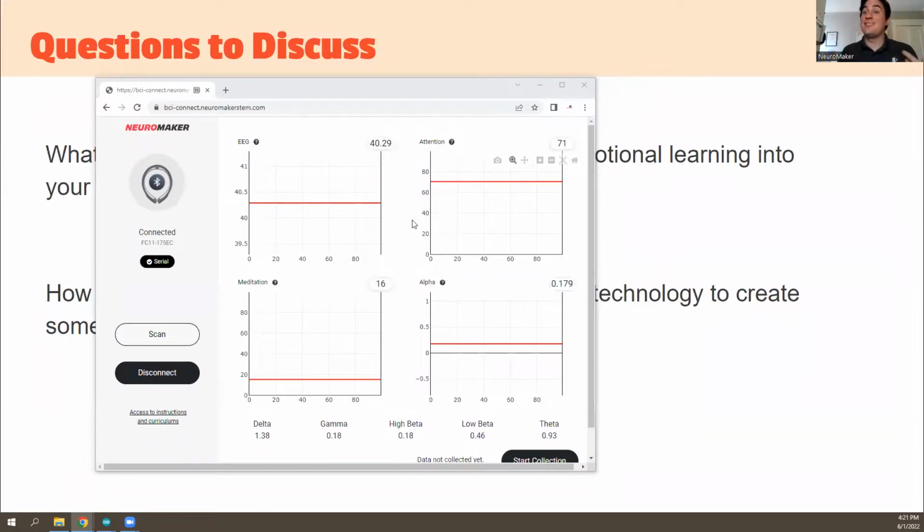If you go to a hospital, you'll see, like you might have seen before, different skull caps with up to 40 or more different sensors on top of your brain. Those are tailored towards very specific, minute brain signals, giving you the resolution for things that are more medically complex.